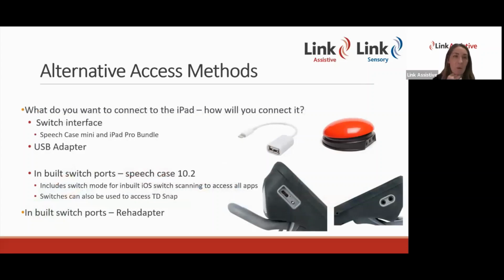And that's where your clinical team can help you to identify what you might need. But we do have access to all of those products within our range as well. And it's just good to know that even if we can't operate a device by touch, there are other ways out there, and that would involve working alongside your client and maybe their wider therapy team around how they might operate a device if touch is more challenging for them.